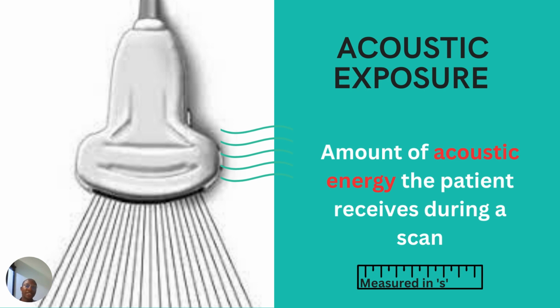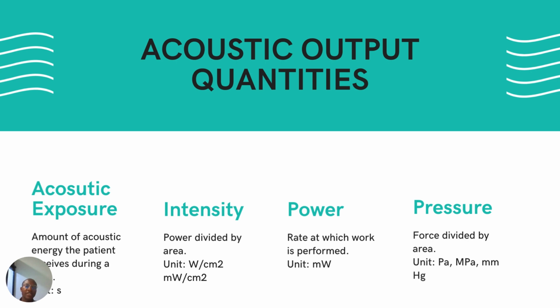However, this acoustic energy is not as dangerous as X-ray. It's not as dangerous as a CT scan, but there are still elements of safety issues that need to be maintained in order to make sure that we are discharging our duty with utmost diligence. So acoustic exposure is the amount of acoustic energy the patient receives during a scan. If you are going to do a 10-minute scan, you are exposing the patient to ultrasound energy for 10 minutes, and vice versa.